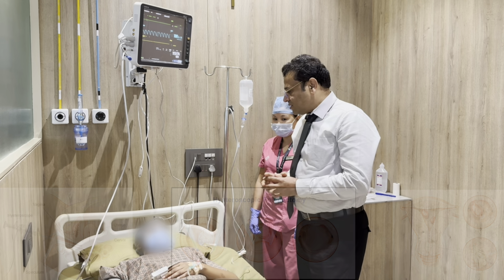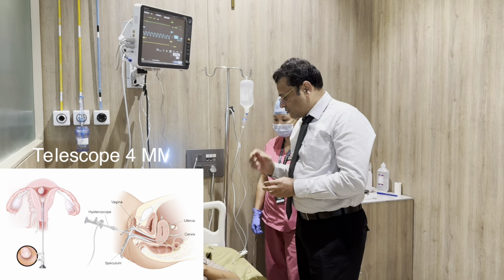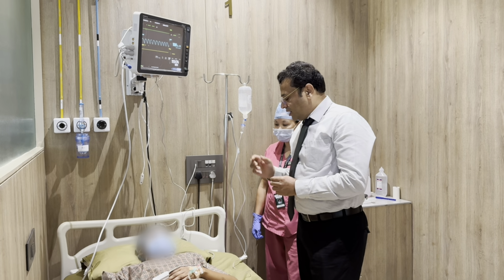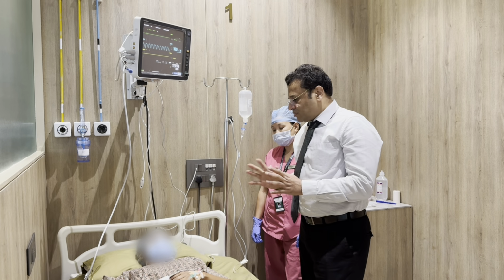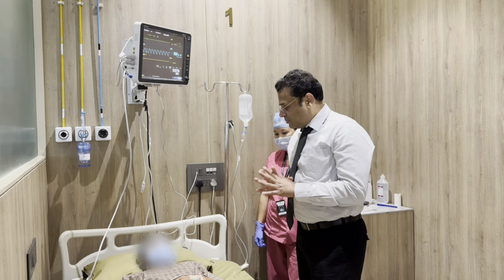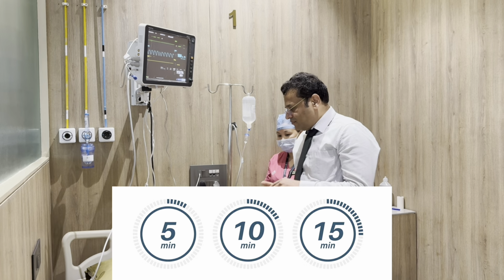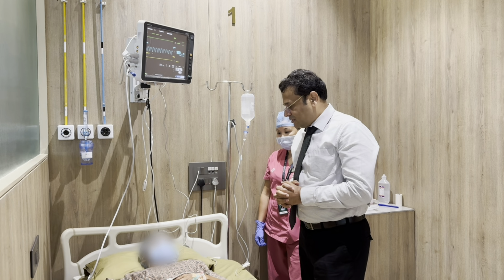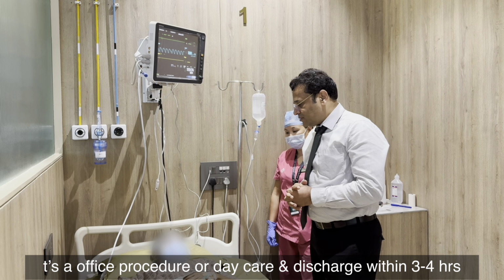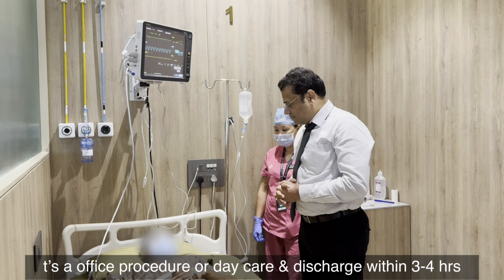We will use a 4 mm tiny telescope that we will introduce through the cervix into the uterus, and we will remove the polyp. The procedure will take 10 to 15 minutes, and you will be discharged today itself. From next month onward, we can go ahead with the fertility management. Do you have any doubts or queries regarding today's procedure? Okay, fine.